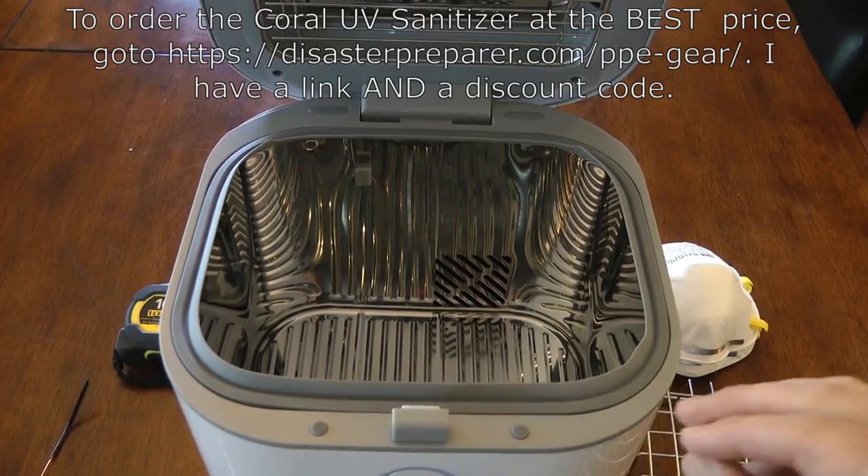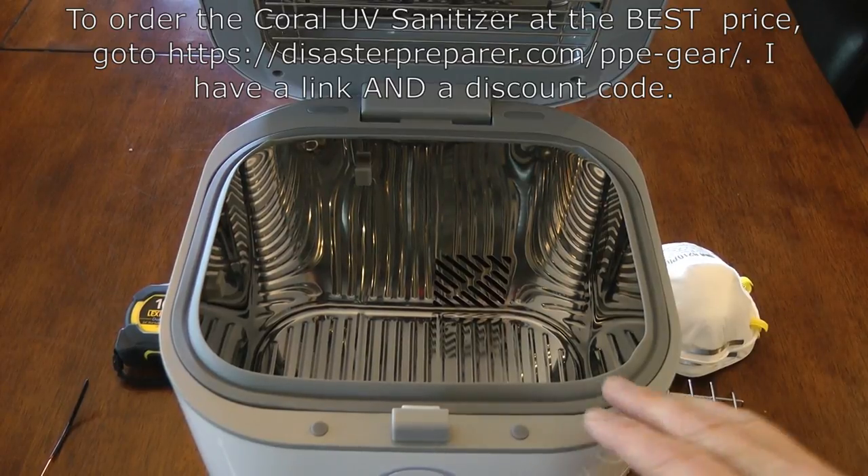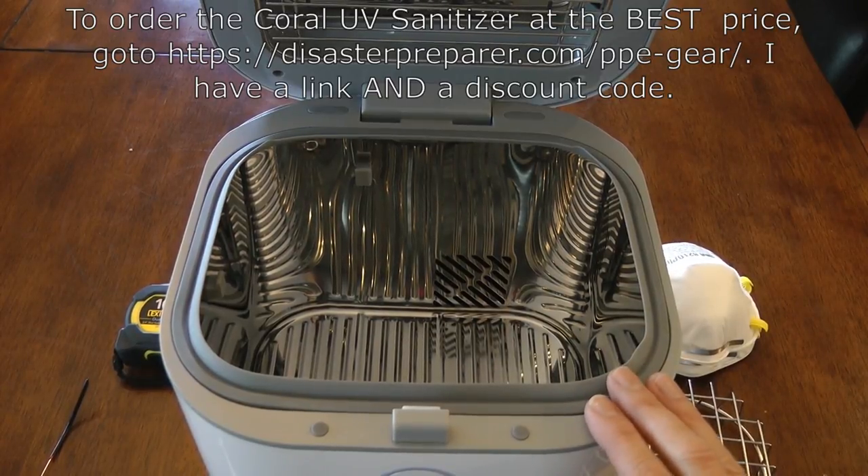The purpose of this video is to show how to install small metal hooks in the Coral UV Sanitizer to better support N95 respirators.